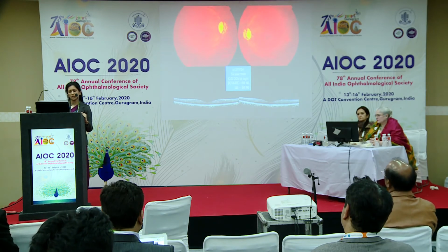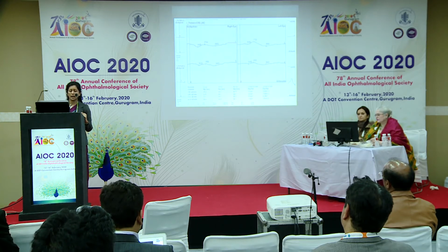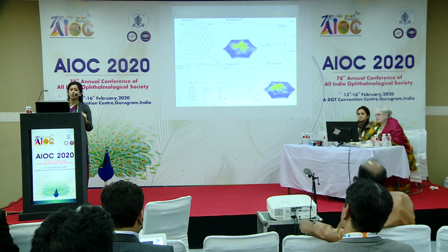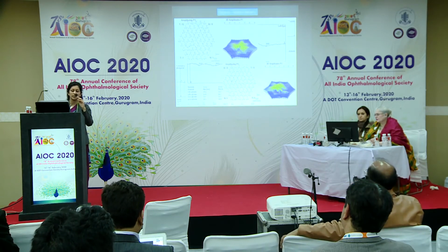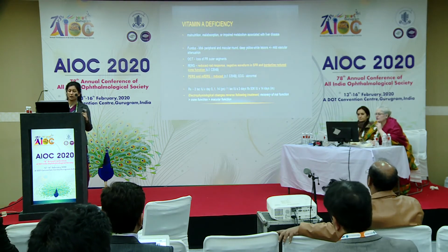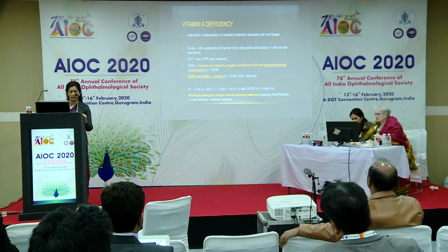This is the third case of nyctalopia, again normal fundi, normal OCT, and normal vision. It does have an inverse B wave as well, but if you look again, the pattern ERG is also depressed, and so is the multifocal ERG. So this would not happen in a CSNB. This is actually a case of vitamin A deficiency, which after the ERG we retrospectively asked, and the patient was that of alcoholic liver disease. So this is another diagnosis in the spectrum of nyctalopia, and of course important because it is treatable, and the ERG changes do also reverse following treatment.